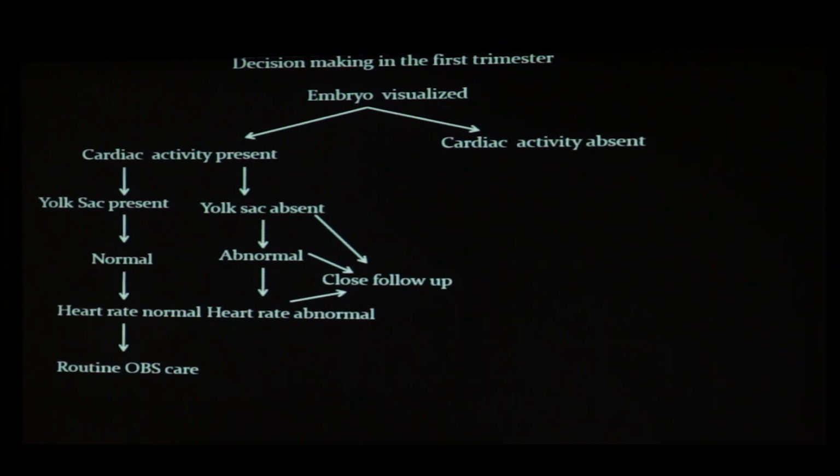The cardiac activity absent, but make a note, make a point, it is not absent, it is non-visualized. So don't report that cardiac activity is absent. Please put your physics to work. Then you will see in more than 70, if not 80%, that I am sure, if you put your physics in more than 70-80% of patients, you will get the fetal cardiac activity.